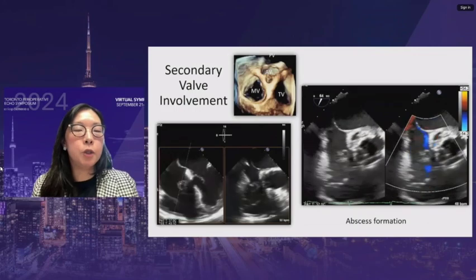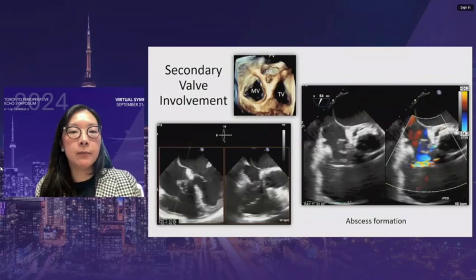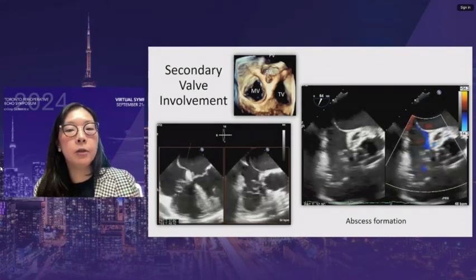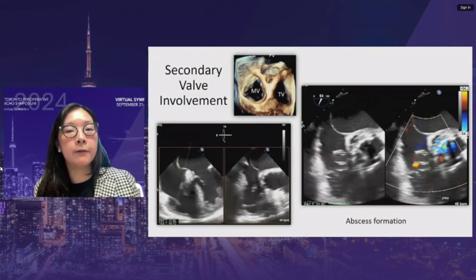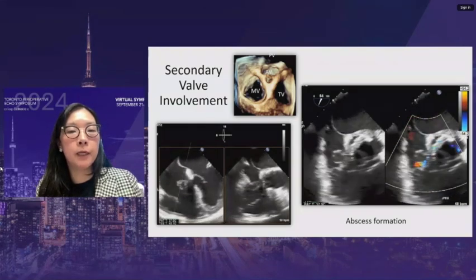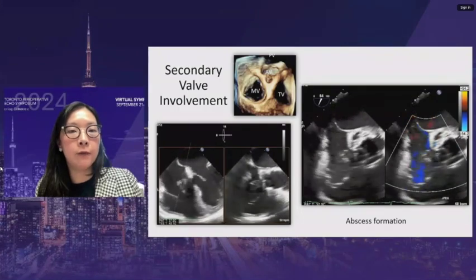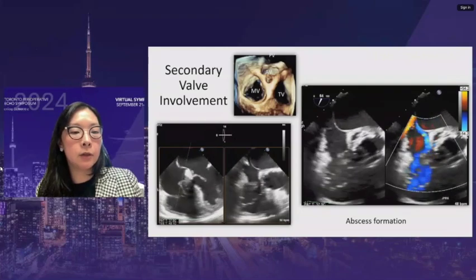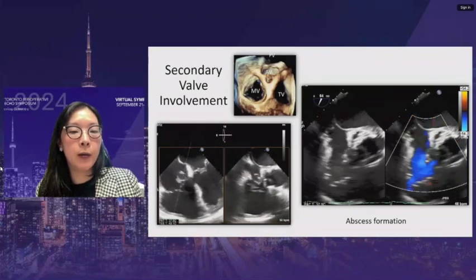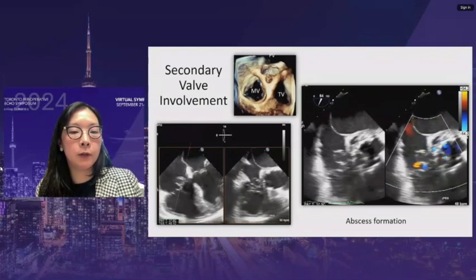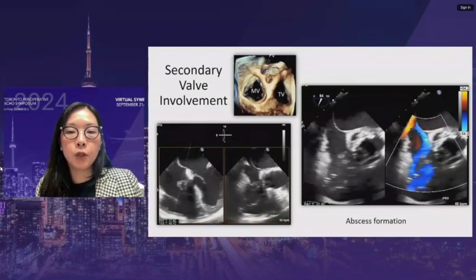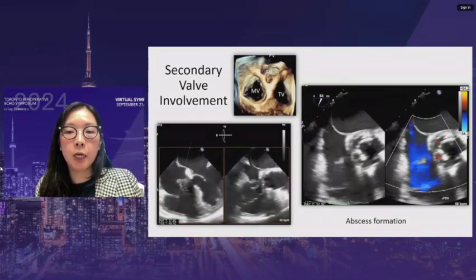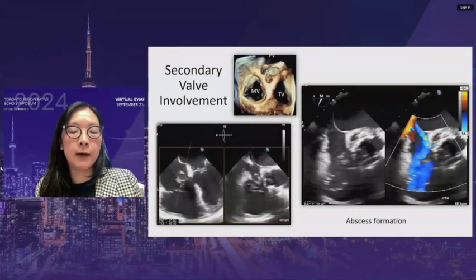Secondary valve involvement can also occur via abscess formation, not just jet direction. A 3D image shows the close proximity of all cardiac valves and how abscess formation can infect another valve. A large vegetation on the septal leaflet of the tricuspid valve is shown to be very close to the aortic valve on biplane. A short axis view of the bioprosthetic aortic valve reveals an abscess with a jet going into the tricuspid valve — this is how the tricuspid valve was seeded.